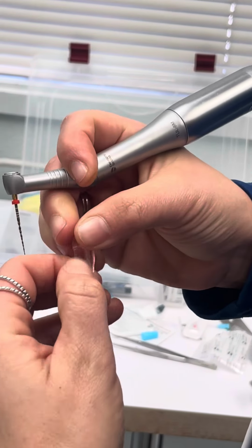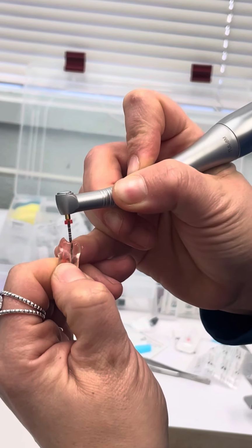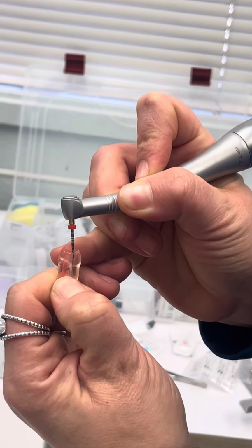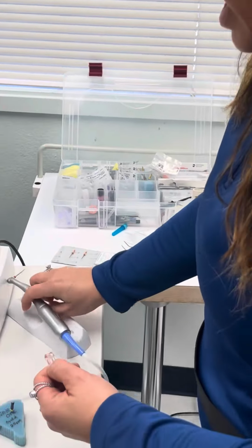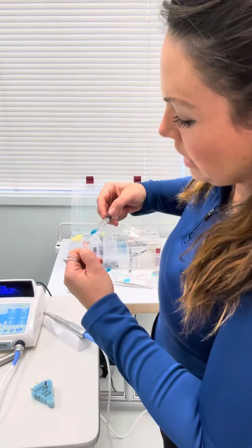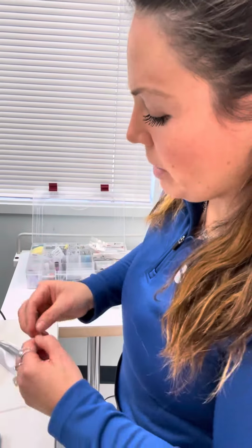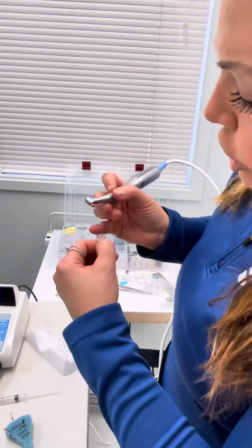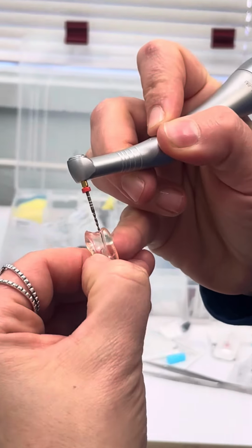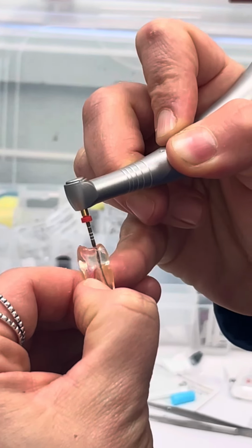Mesial. It's getting so slippery. Lingual. Distal. This file is actually designed to be an orifice modifier as well, but it's not a great one because it is so long. But you can sweep on the outskirts and it will do a very similar action. I don't recommend removing your orifice opener for this one though.